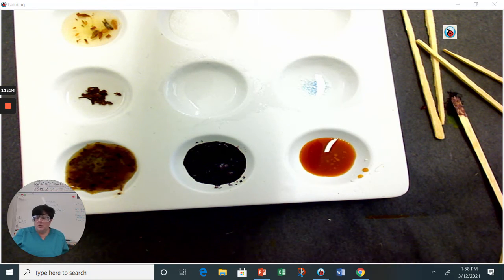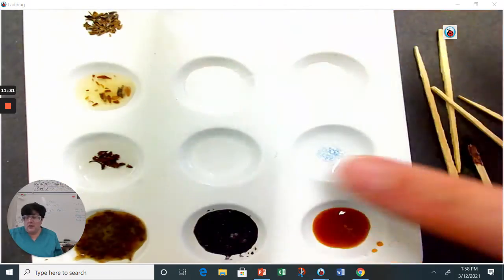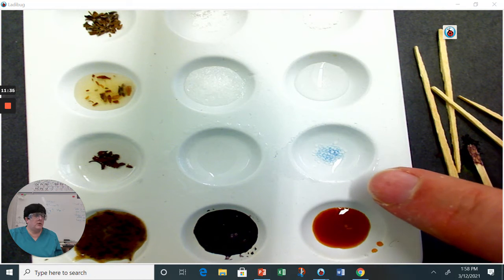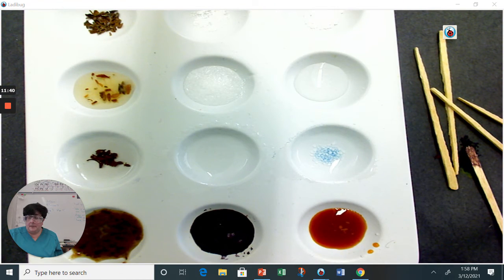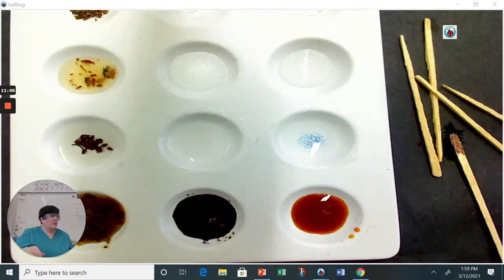So those are what we call presumptive tests that you do. You check its reactivity. You check whether it reacts with a particular agent that turns out a particular color. Like I said, with cocaine, you're looking for that blue color on the reagent. And then on this one, this turns really purple, and this is a ruddy brown. Okay, so that is that particular part.